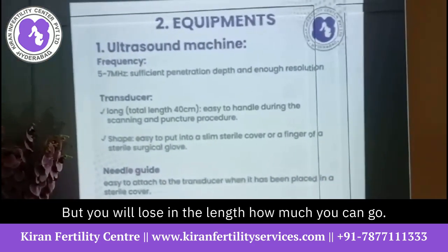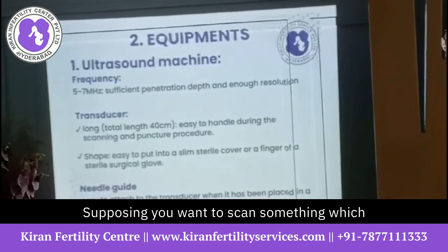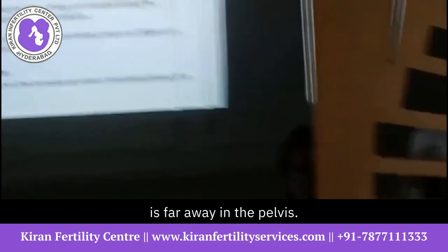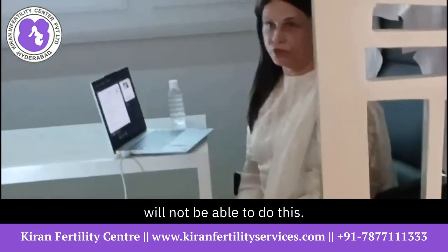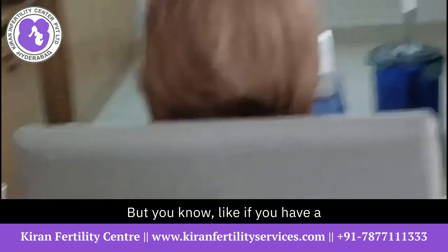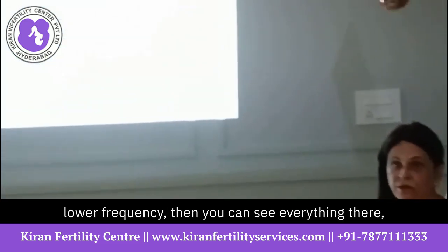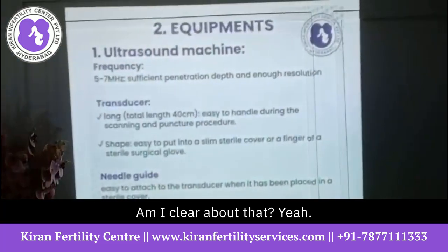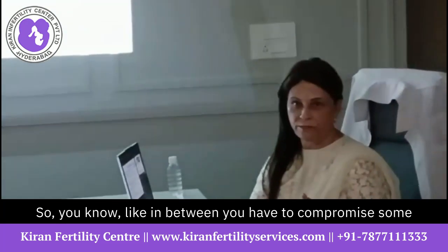But you will lose in the length. How far you can go, you will lose that area. Supposing you want to scan something far away in the pelvis, if you use a high frequency probe, you will not be able to do it. That I will practically demonstrate to you. But if you have a lower frequency, then you can see everything there, but the clarity will be less. Am I clear about that?